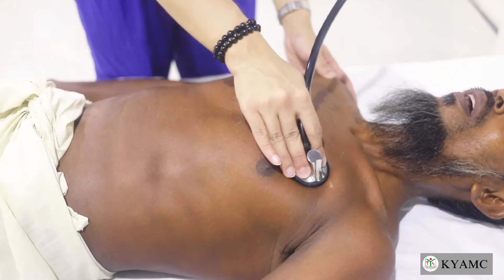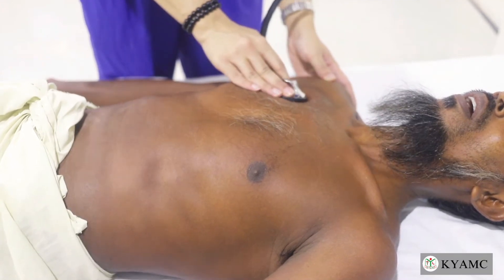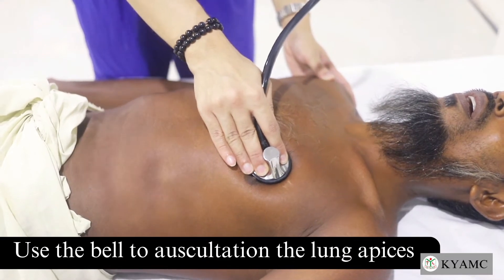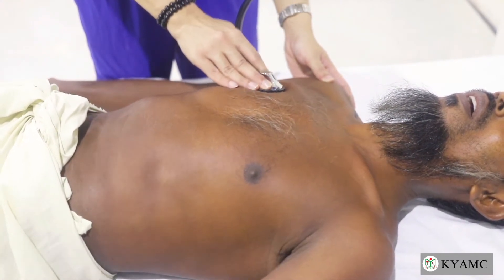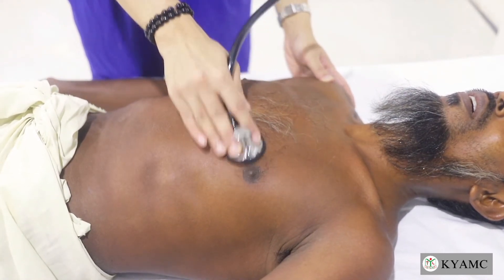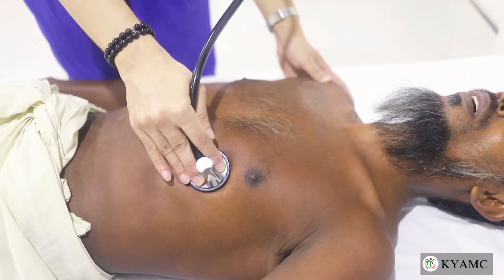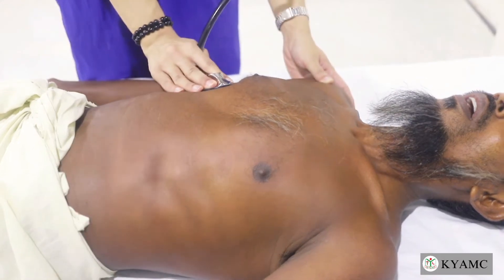The demonstrator is using a master cardiology stethoscope. Please use the bell of your stethoscope to auscultate the lung apices. Move downwards along the same areas in the mid-clavicular line as shown in percussion and vocal fremitus. Compare the corresponding intercostal spaces for abnormalities in the breath sounds or any added sounds.